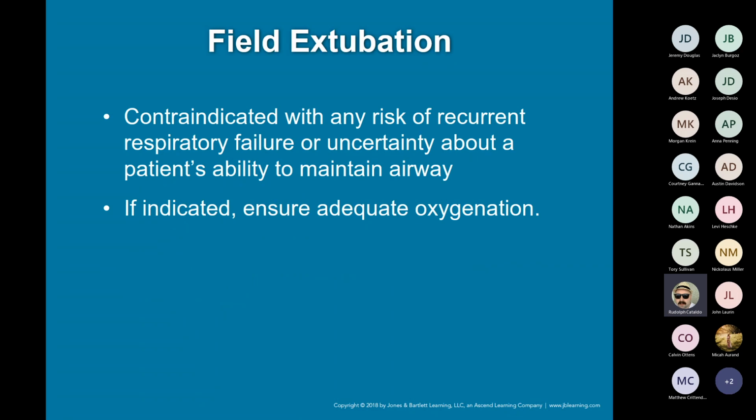If my patient is truly being ventilated, or I'm bagging them, or they're on a vent, whatever it might be, there'd have to be a pretty extreme reason for me to extubate them. I've never extubated somebody in the field. Yeah, you have a cardiac arrest that you end up calling on scene, you're waiting for the medical examiner, and maybe you extubate them or something like that. That's a different story potentially, but on a patient that you're assessing that's intubated, we shouldn't be removing the tube unless, again, there's extreme circumstances.